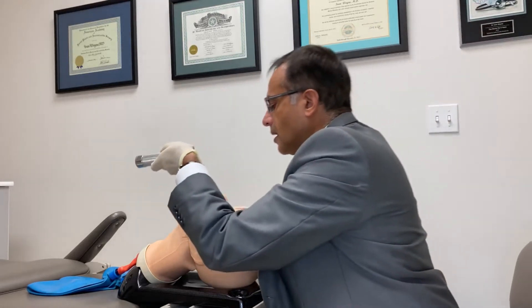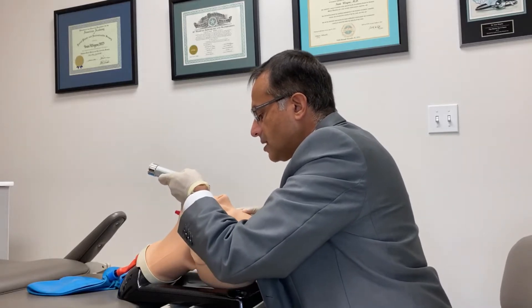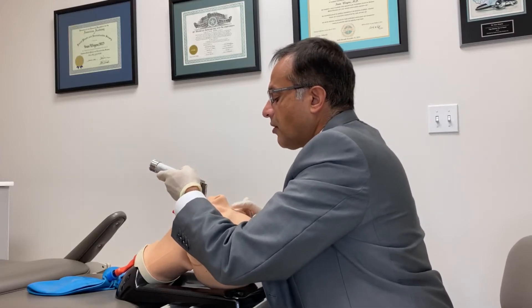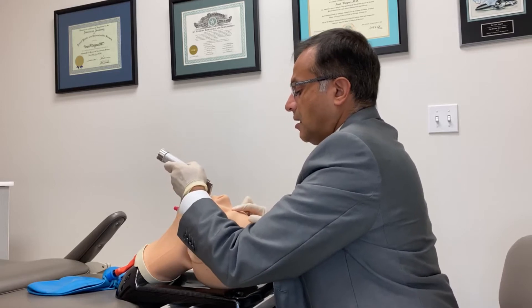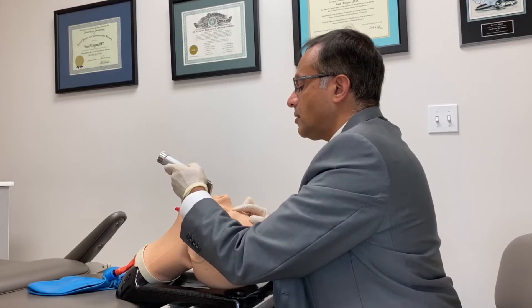Let's put that in — this is a mannequin that does not have the tongue inflated and doesn't have a collar on it. It's very high profile so I'm pushing really hard, and you can probably see me struggling a little bit, but I can see the airway and we can pass an endotracheal tube between the vocal cords.